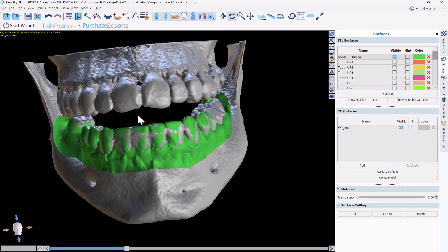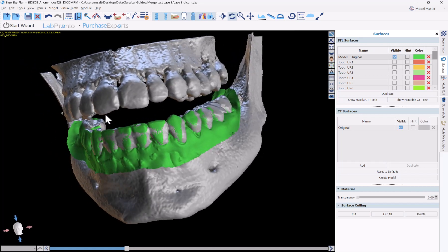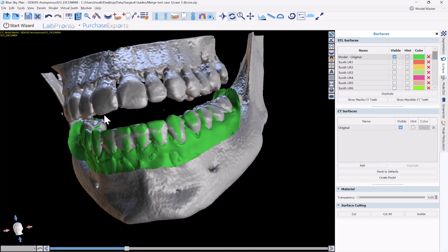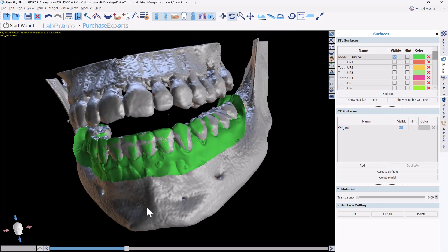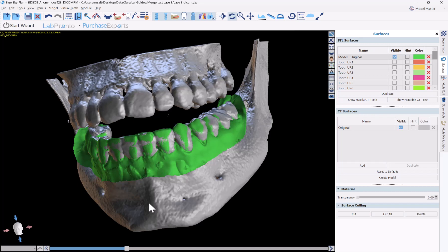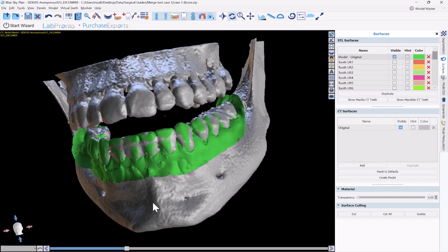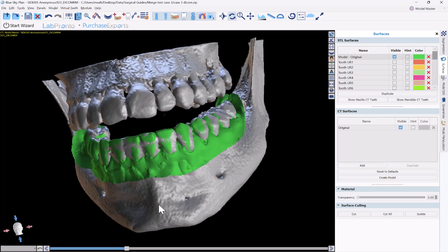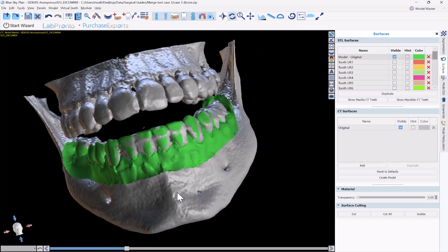Hello everyone, this is Michael from Blue Sky Bio. In today's training tutorial, I will demonstrate how to extract a tooth from the STL model. This is a technique that Dr. Corey Glenn presented in one of his webinar presentations. I'll demonstrate a few different techniques, but we're going to start with the technique that Corey presented.